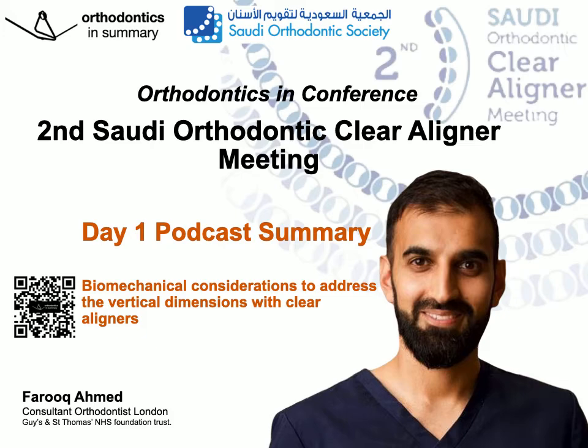But that's not just it. As we described earlier on for rotation, there's the squeeze effect, the old toothpaste tube. When we are creating that rotational horizontal force, there is going to be vertical movement as well. So we've got to counter for that in our attachment design. So what do we need to do? Well, we need to place the attachment in an oblique fashion. So there is some extrusive vector as well as some horizontal vector as well.